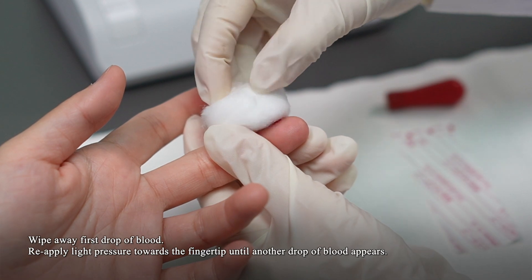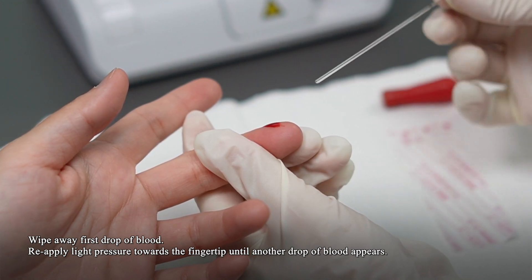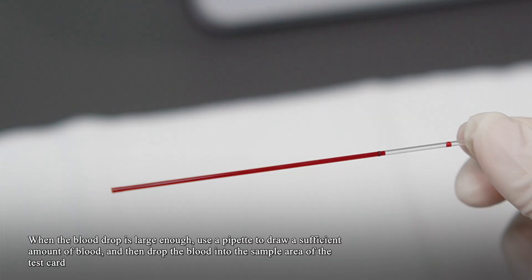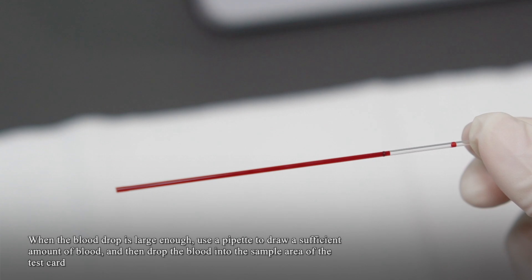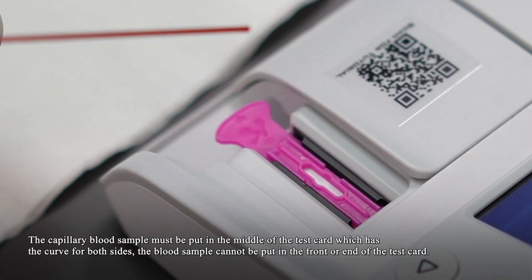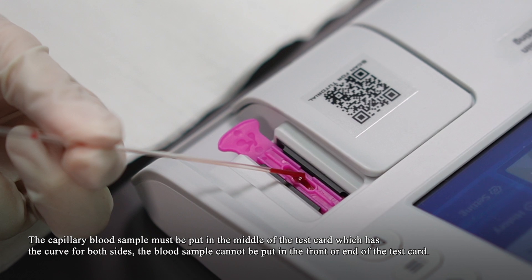Wipe away the first drop of blood. Apply light pressure towards the fingertip until another drop of blood appears. When the blood drop is large enough, use a pipette to draw a sufficient amount of blood, then drop the blood into the sample area of the test card. The capillary blood sample must be placed in the middle of the test card within the curved area on both sides. The blood sample cannot be placed at the front or end of the test card.